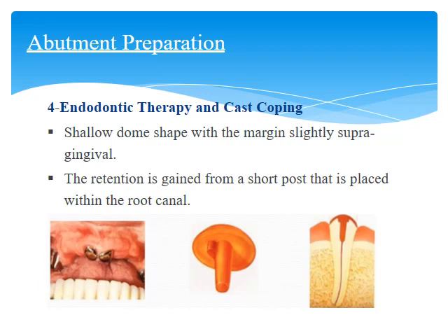The endodontic therapy and cast coping. Shallow dome shape with the margin slightly supragingival. The retention is gained from a short post that is placed within the root canal.